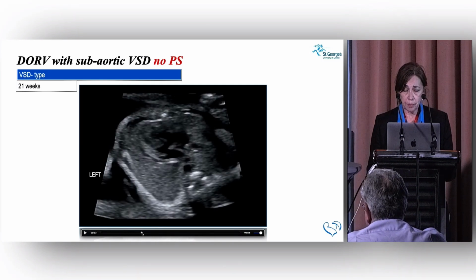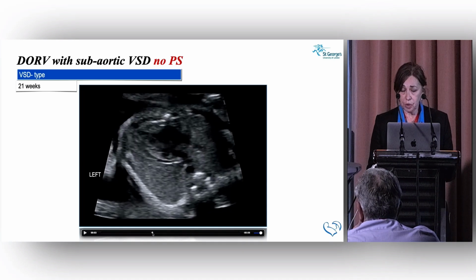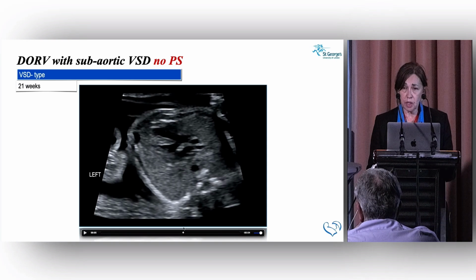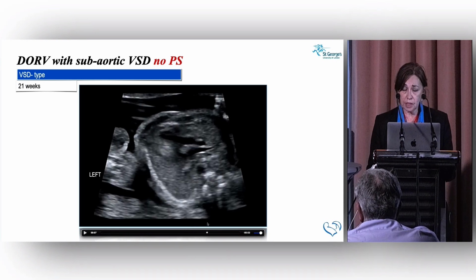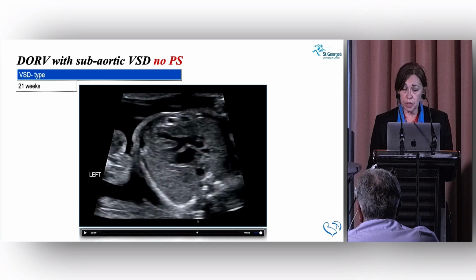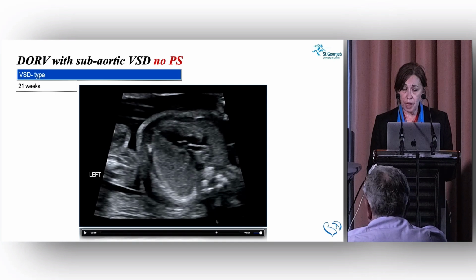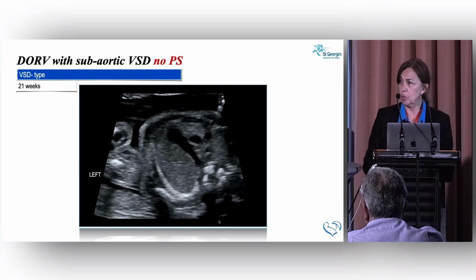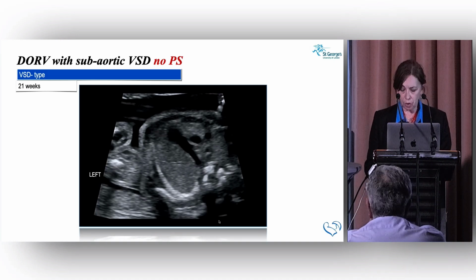So here we have the left ventricle, the right ventricle, an overriding vessel, which could be anything, until we see the second vessel, if there is one. As we move up in the mediastinum, you can see the aorta overriding the VSD, and we only know it's the aorta because as we go further, that's the aortic valve, which is coming predominantly from the right ventricle, more than 50%. And then as we go further, we have the pulmonary. You can see that three-vessel view is practically normal because there is no obstruction and the vessels are normally related, so they have the crossover.